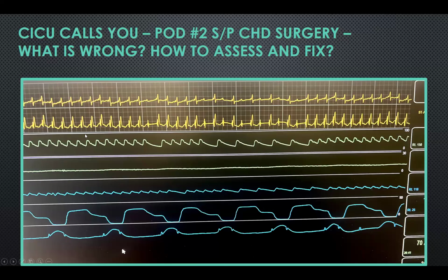So I think this is just the pacemaker modality of the monitor where, as you know, the monitors in the ICU can be programmed to sense a high frequency pacing spike and augment it. And the theory is that it makes it easier for bedside staff to know what's going on in regards to the pacemaker. And many of you have heard me say how much I don't like that modality because I think it can be confusing. People confuse the spike with capture, which is not always, of course, the same. So, what do you think's happening here, Vlad? Is there a problem even? And if yes, what would you do about it?